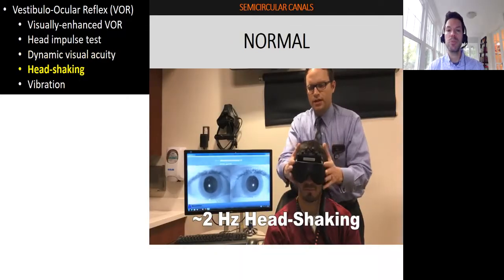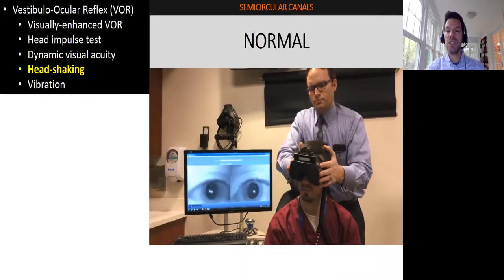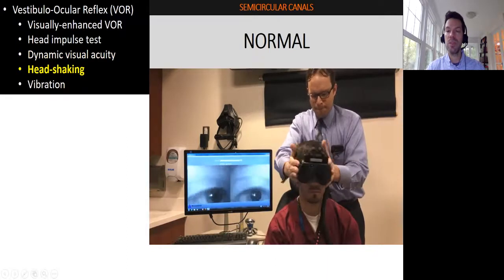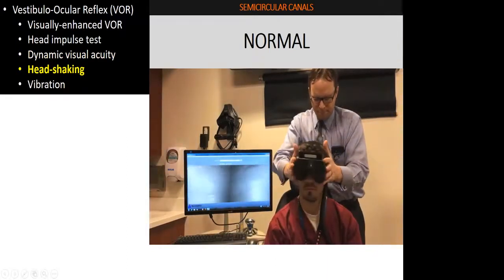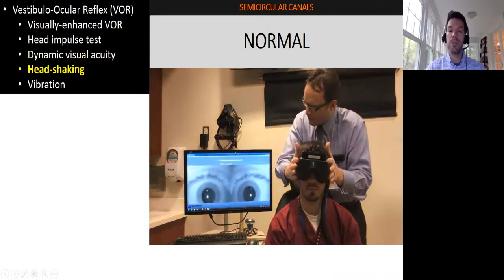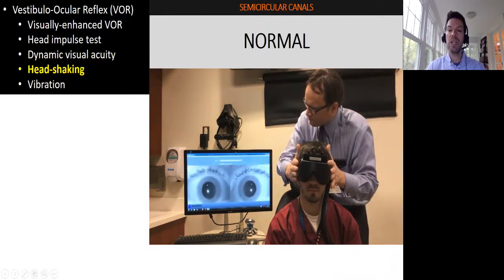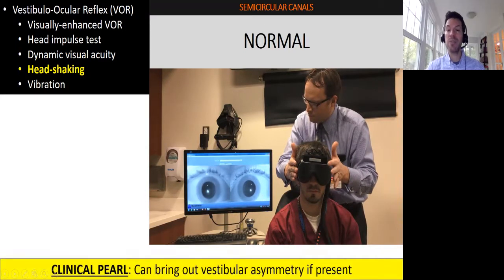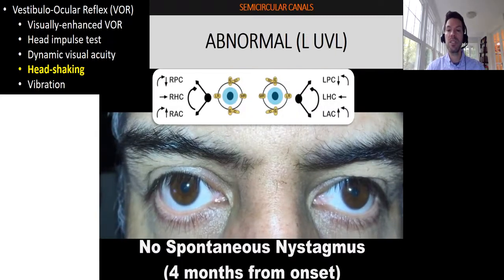Now I'm going to shake your head side to side for about 10 seconds. This is head shaking. This is a provocative maneuver. It's nice to remove fixation in some way. These are infrared sort of video Frenzels. You're shaking the head for about 15 cycles at 2 to 3 hertz and looking for any head shaking induced nystagmus. This is a normal patient who didn't have any. And if there's any vestibular asymmetry, this can bring it out. So even if a patient has had a vestibulopathy months ago or years ago, this can often bring out that asymmetry.